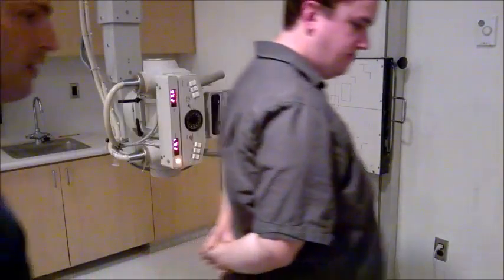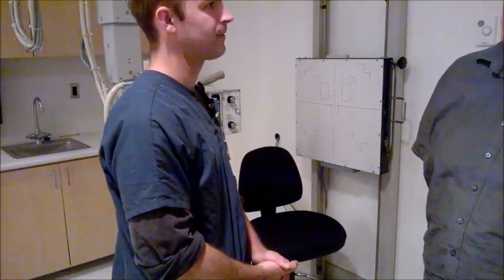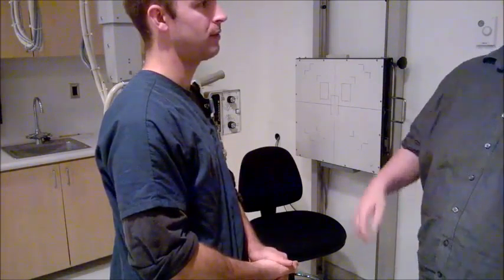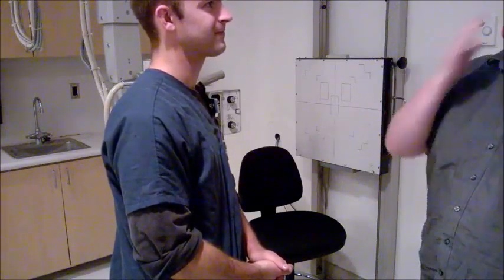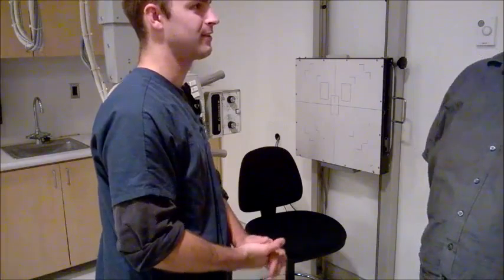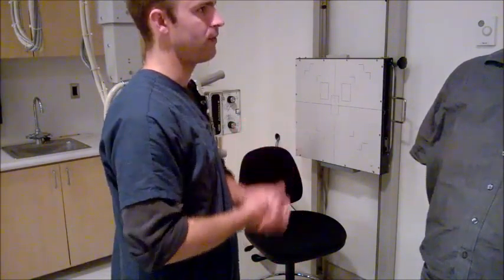Right this way, sir. So what is your first name, last name, and date of birth, sir? Matthew Ryan, 3/20/1986. Okay, what seems to be the problem? I hurt my jaw. It was an athletic thing. I'm a world-class pie eater, and I just think I overdid it finally. Oh, wow. So it's been hurting a little. Oh, that sounds fun. So we're gonna do a mandible series on you, okay? A couple, four views, all right?